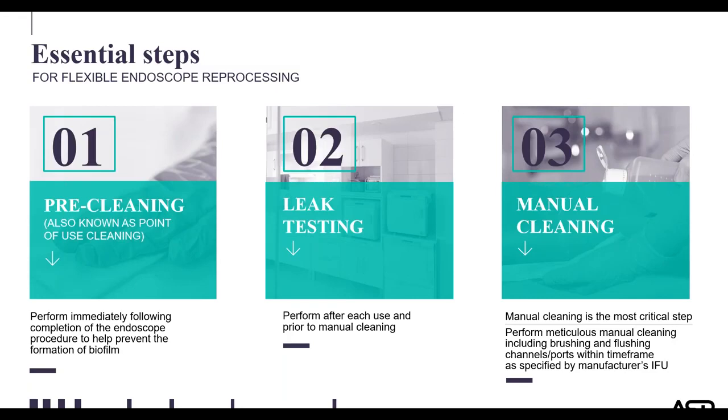So the thing about cleaning solutions is that they can adhere to the scope if you use too much, and they may not be effective if you use too little. So the analogy I like to use is going to the restroom and I wash my hands. I put a little too much soap on my hands and I do my 20-second rinse, but I'm kind of in a hurry. So after the 20 seconds, I grab a towel, dry it, and then I touch a surface and it's sticky. So the same thing can happen to your scopes.